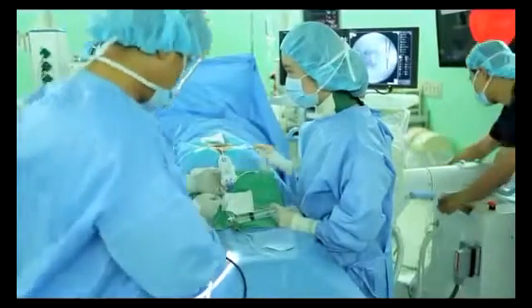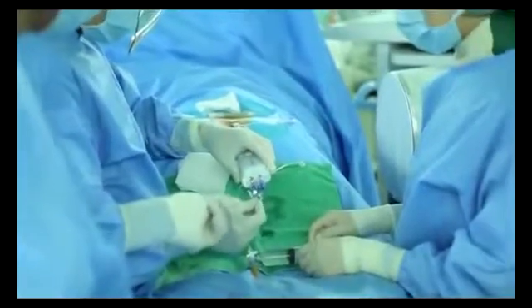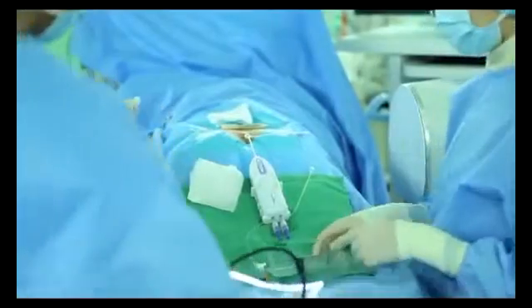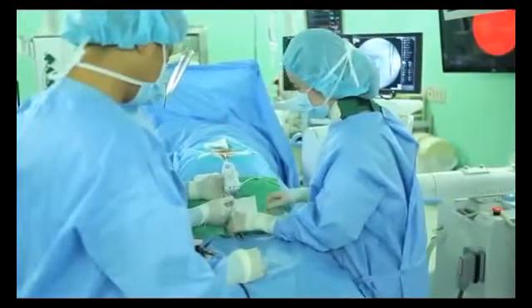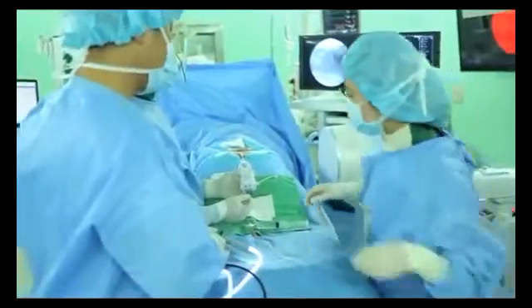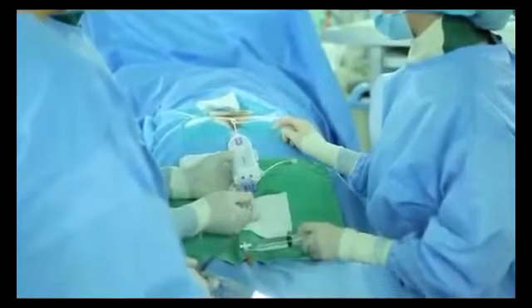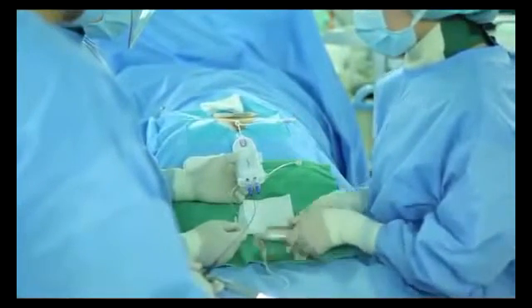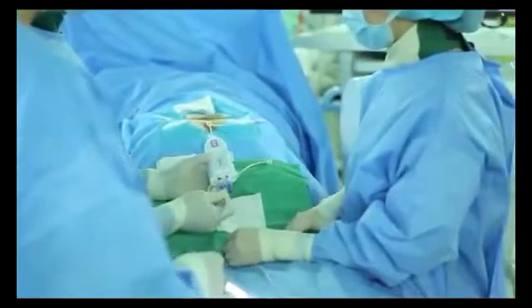You take out the endoscopic cable. Then, clear the cable tip with the wet gauze or check any substance on the connection part of the endoscopic cable. The purpose of the saline injection is to secure the way for the catheter advancement and to have a clear vision around the endoscopic cable. You may continue injecting 1 cc of saline by way of pumping, and you will see a clearer view during the 1 cc pumping moment.